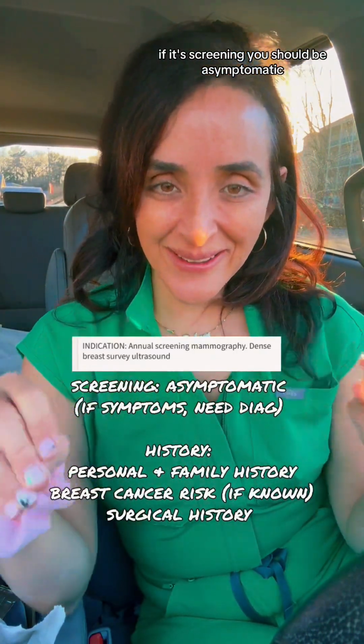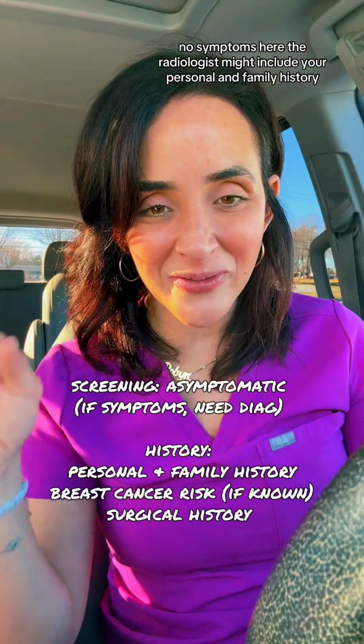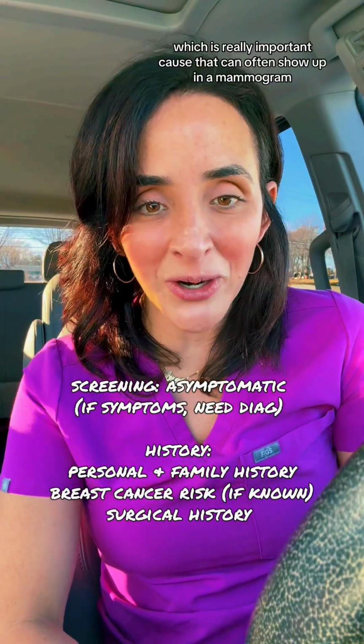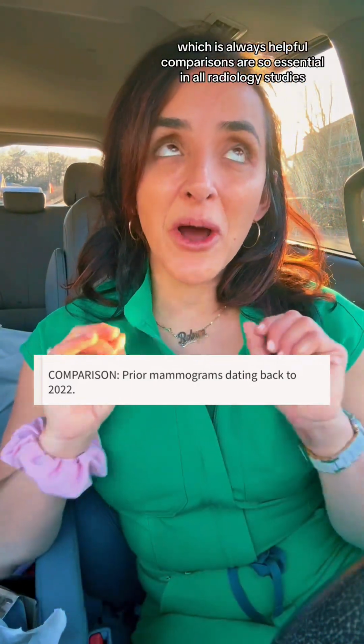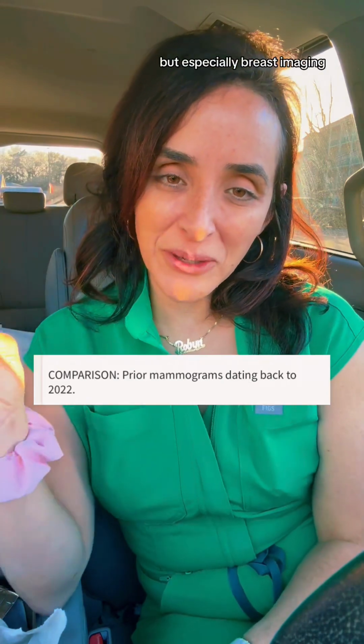So under here, you'll see history. If it's screening, you should be asymptomatic, no symptoms. Here, the radiologist might include your personal and family history of breast cancer. Also, any surgical history, which is really important because that can often show up in a mammogram. We're going to compare it to last year's imaging, which is always helpful. Comparisons are so essential in all radiology studies, but especially breast imaging.